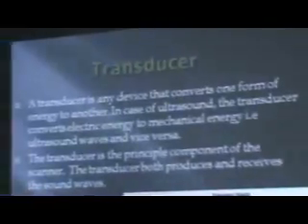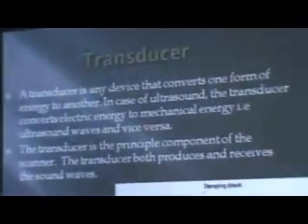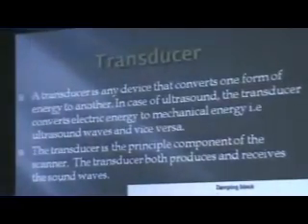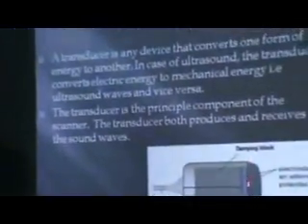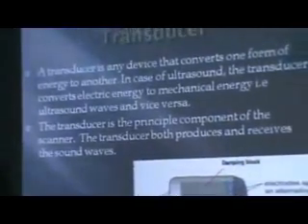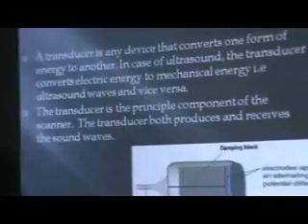The transducer or the probe of the machine is the key component of the machine, and a transducer is any device which converts one form of energy to another. In case of ultrasound, as I have already told you, there are piezoelectric crystals inside the transducer, and when electrical current strikes the crystals, electrical energy is converted into sound energy.